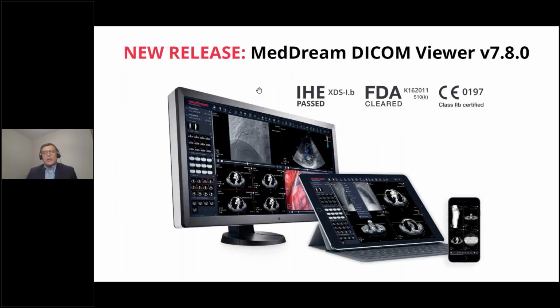So, as I said, this is a new release. The new version number is 7.8, and it is already available on our website for download and implementation. All related documentation is also available on the web page, which you can download, read, and use.